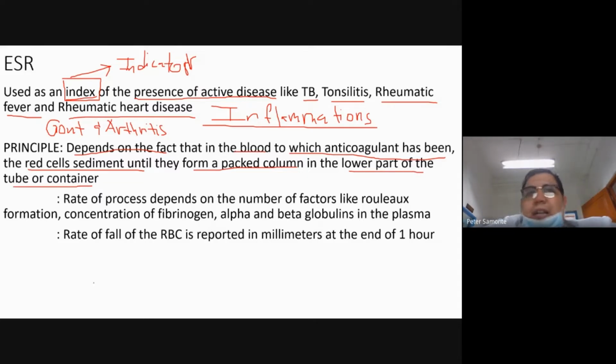So if you recall sa phlebotomy nyo, sa order of draw nyo, sa EDTA nyo, you would put a certain amount of blood, depende sa required volume ng tube nyo. There would be an exact amount of anticoagulant. Now you would have your whole blood. Now itong whole blood nyo, this is your blood plus anticoagulant.